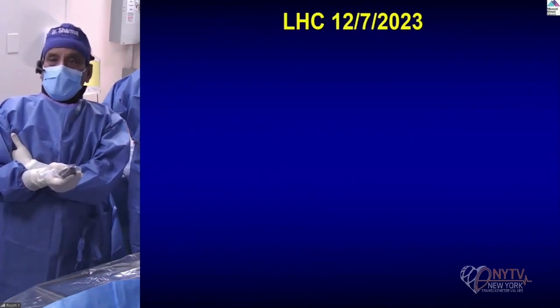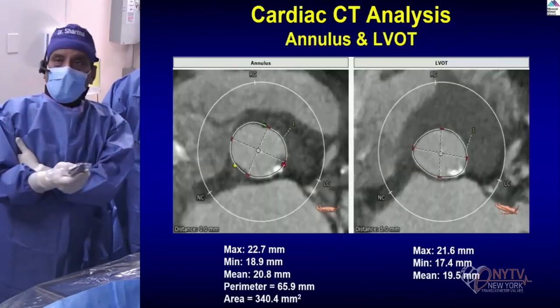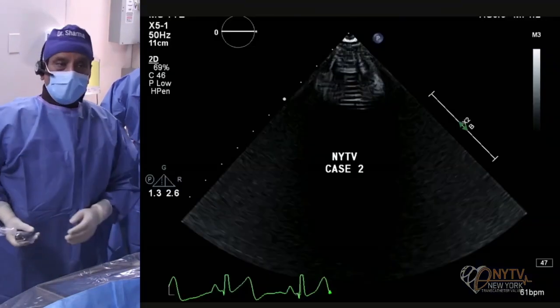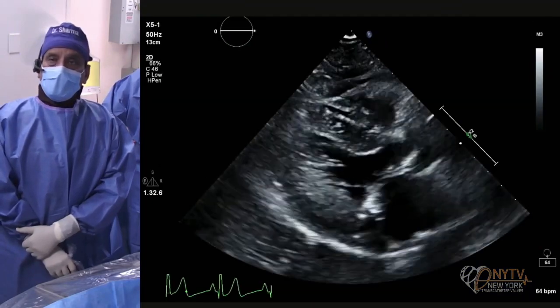The patient has moderate to severe AI. Catheter coronaries are normal. Yeah, coronaries are normal. And Lucy Safi will show the live echo, if we can show it, and then we'll go to the hemodynamics. All right, so here's our live echo.